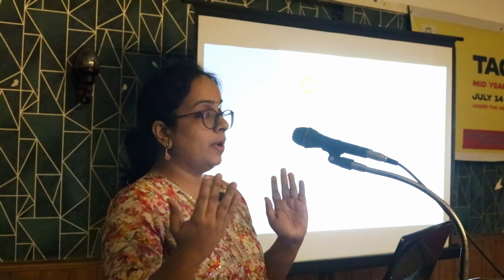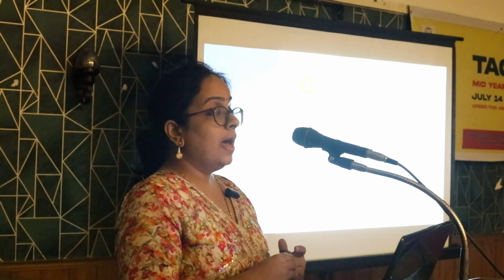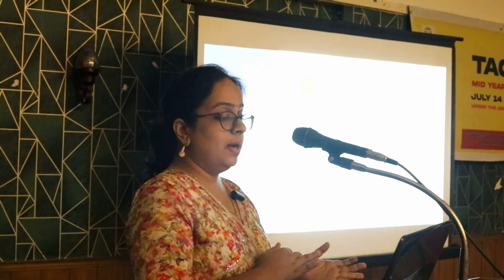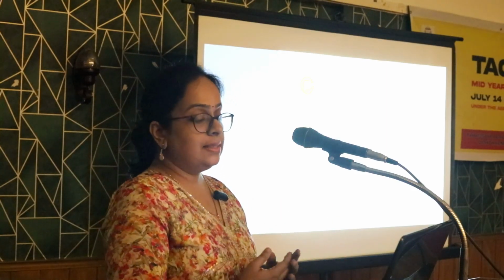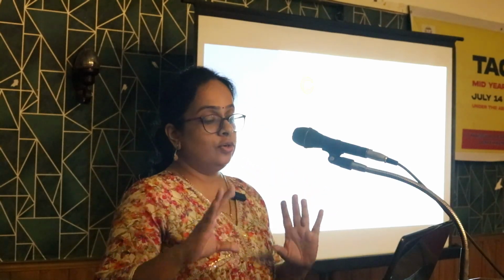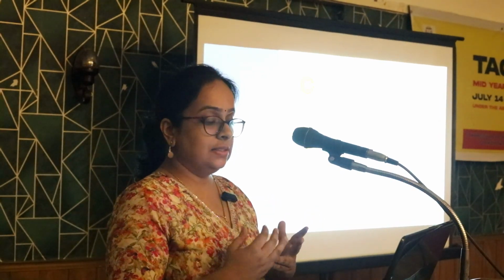So the future directions are quantification of the functional damage and the structural damage. This can be incorporated into AI and machine learning algorithms to analyze and identify patterns and correlations, predict the disease and give a tailored individual treatment plan. If you include other multimodal data like OCTA and genetic information, it can increase the accuracy of the diagnosis and help in monitoring the disease. And with all this data, long-term longitudinal studies will help us know more about the pathogenesis of the disease and the patterns of progression.